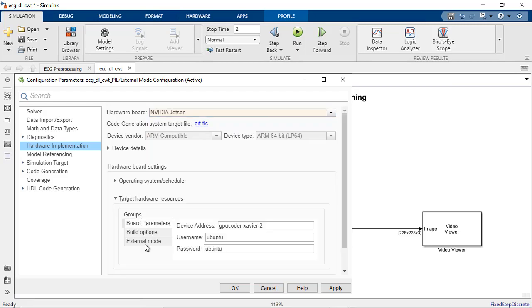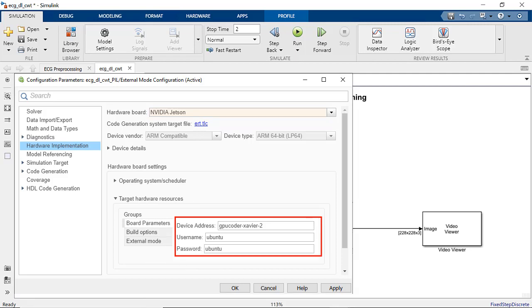From there, under Target Hardware Resources, specify parameters like Device Address, User Name and Password so Simulink can access it.